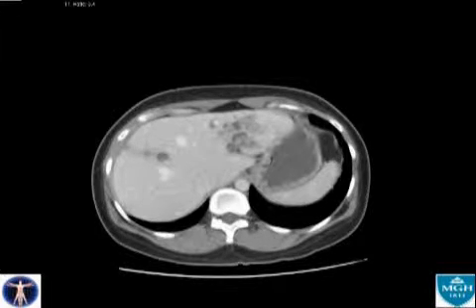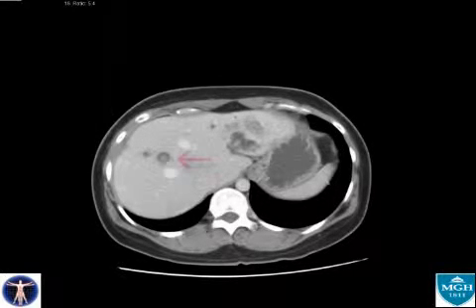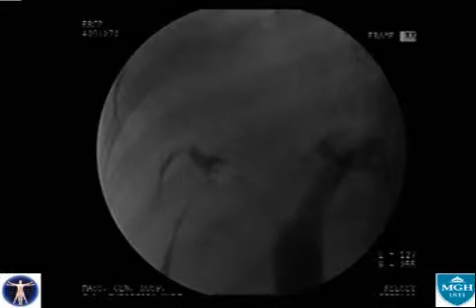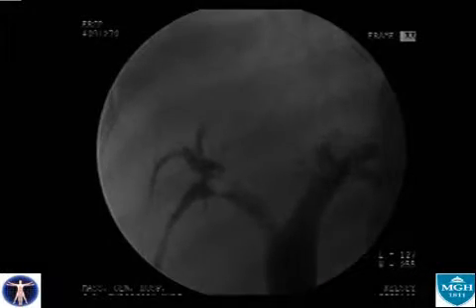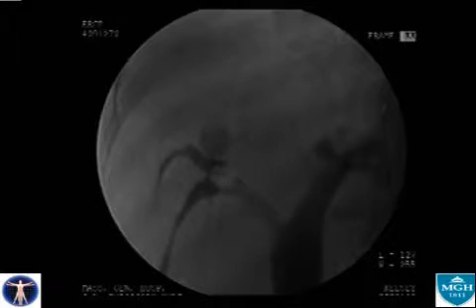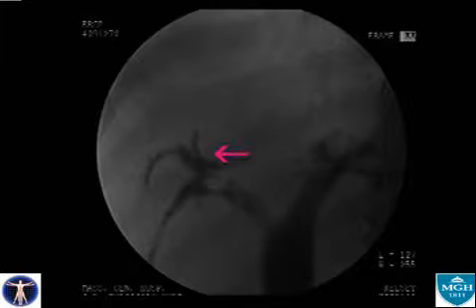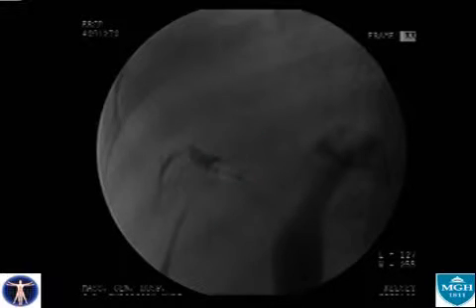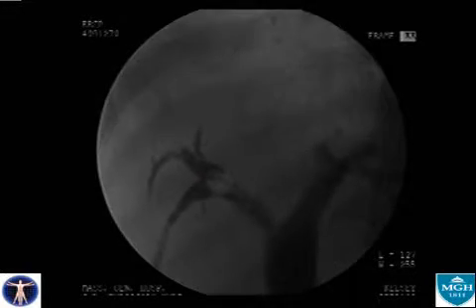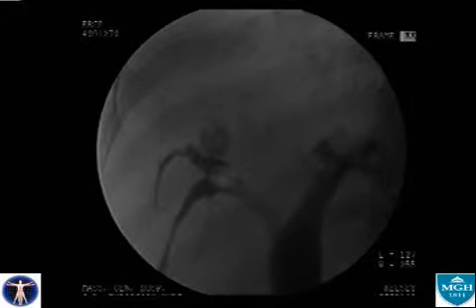This image, however, revealed this one right-sided stone with upstream duct obstruction. She was referred, therefore, in the preoperative period for removal of the stone by ERCP and cholangioscopy. A selective right-sided cholangiogram demonstrates filling of a branch of the right main duct, above which is a filling defect. A slow-motion repeat of that sequence shows that the takeoff of the side branch is significantly strictured, a finding commonly seen with oriental cholangiohepatitis. A balloon catheter is passed into this ductal system.